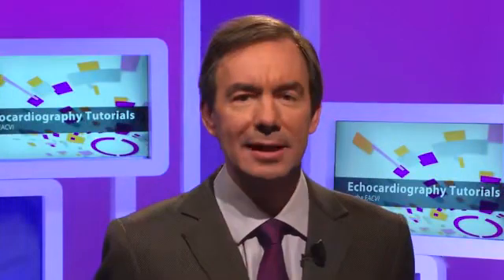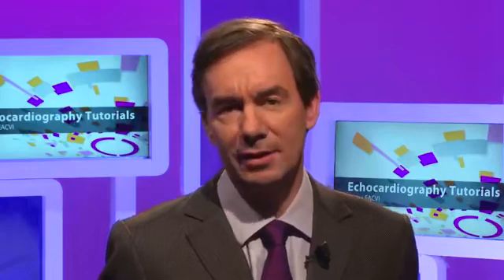So the important messages of this examination are that we have to use multiple views, that of course echocardiography is the first-line examination to assess the morphology of atrial septal defect, to quantify the shunt, which is very important for prognostic value, and finally that we also have to look at the associated lesions at the level of the valves.